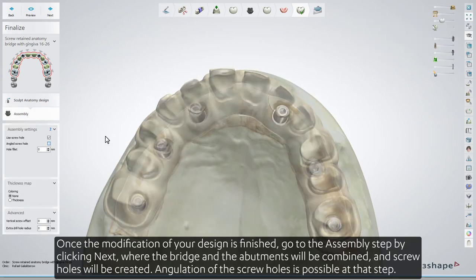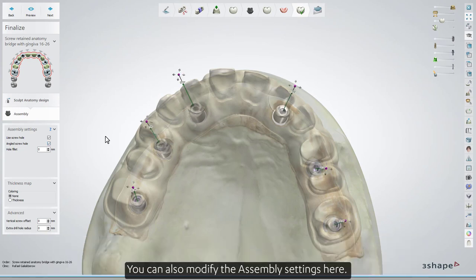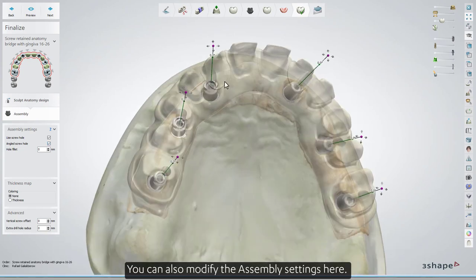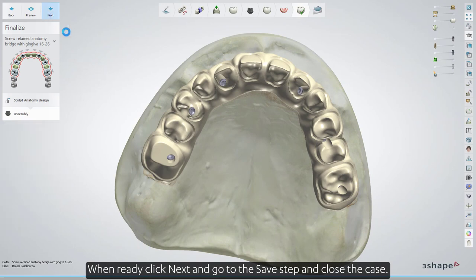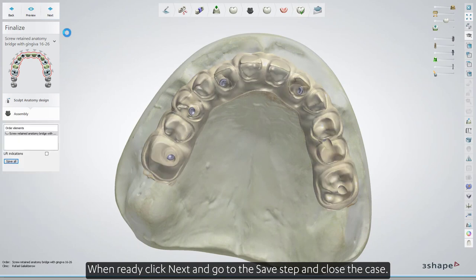Angulation of the screw holes is possible at this step. You can also modify the assembly settings here. When ready, click Next and go to the Save step and close the case.